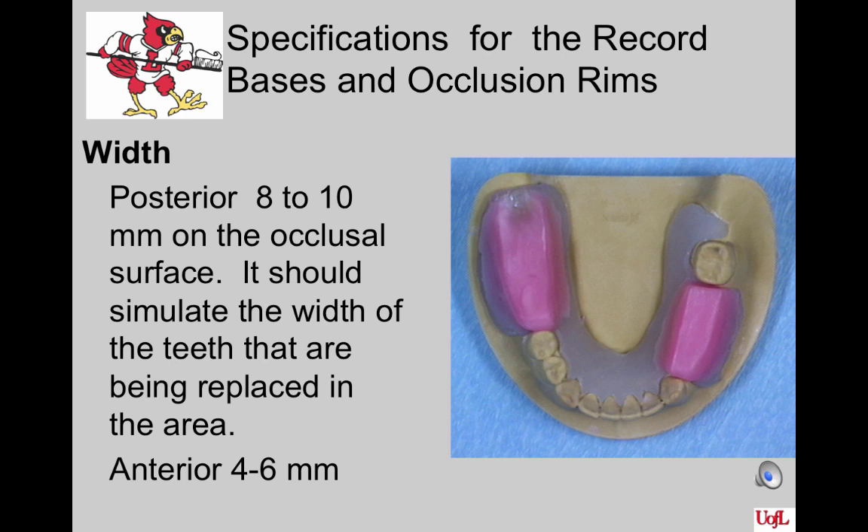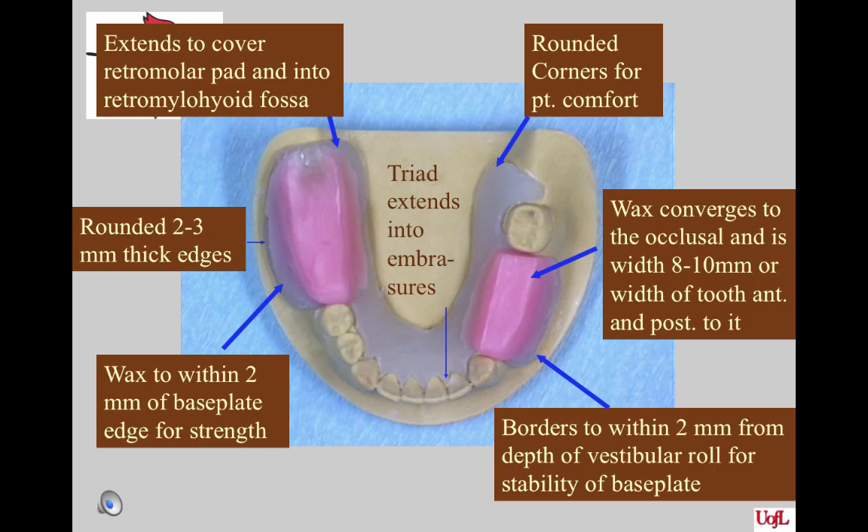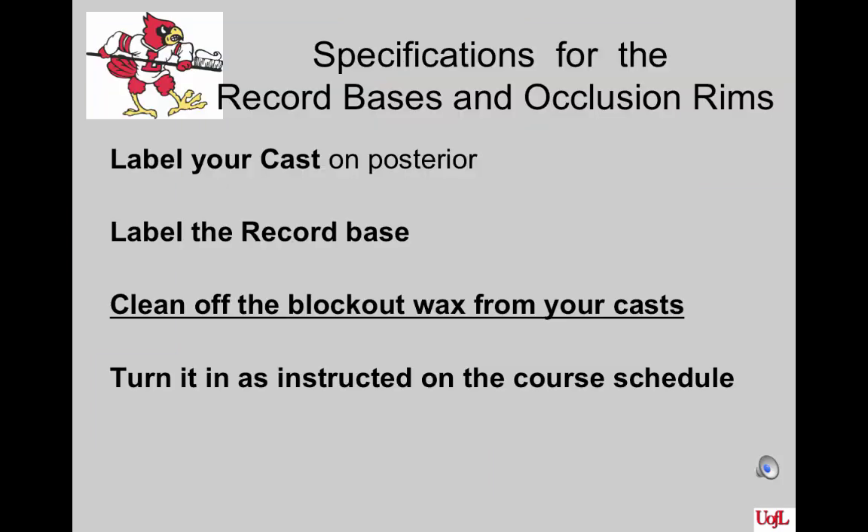Here is a very nice occlusion rim for your viewing. The only thing that might not be perfect is that the wax rim on the edentulous side is a little too wide. This occlusion rim demonstrates how the wax should look — it converges to the occlusal from a broad base attached to the record base. Here is a summary of all the specs discussed for a mandibular occlusion rim. Label your cast on the posterior surface as it sits on the desktop, and label the record base as well since they sometimes get separated. Be sure to clean off the block out wax from your cast before turning it in to the boxes labeled for your unit lab.